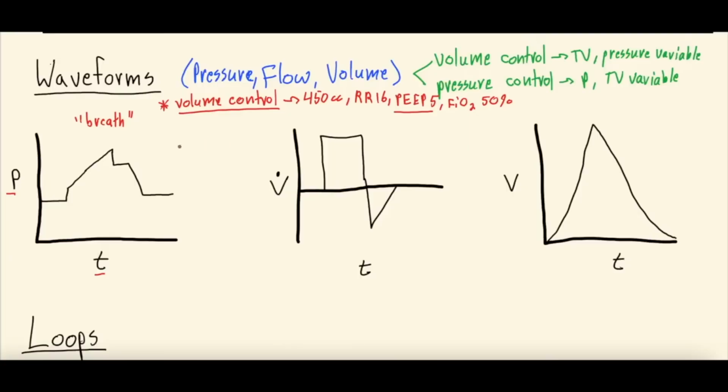So the things we have are, let's see if we can draw, probably not, there's a patient, right? A stick figure patient, they're lying down, here's their arms lying at their side, here's their head, here's their mouth, eyes, and they have an endotracheal tube in their mouth, hooked up to the ventilator machine, right? And the ventilator machine has our waveform stuff, but the ventilator is pumping volume into the endotracheal tube that then goes into their two lungs. And the pressure in this closed circuit, lungs, trachea, endotracheal tube, is what's being shown here.